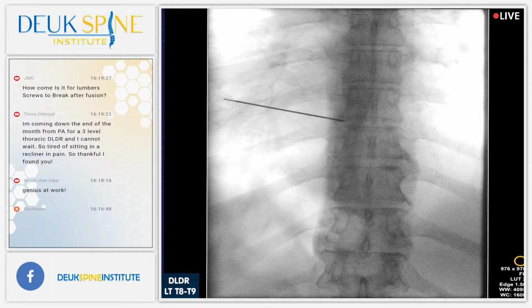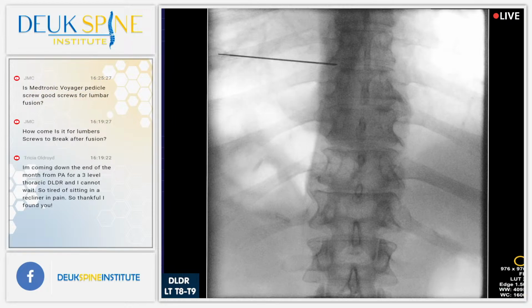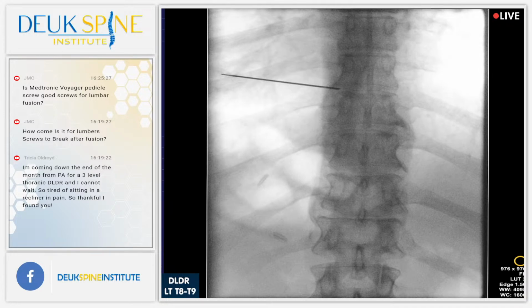So we're going to count ribs up, one down. Come on, take a picture. All right, so a little bit higher, go north by 1/2 inch. Shot. So let's count. Pedicle of 12, 12, 11, 10, 9, 8. We're between 8 and 9. That's the 8-9 disc. I agree.